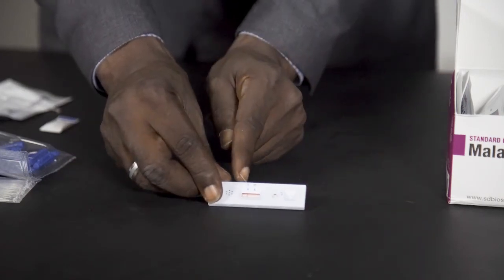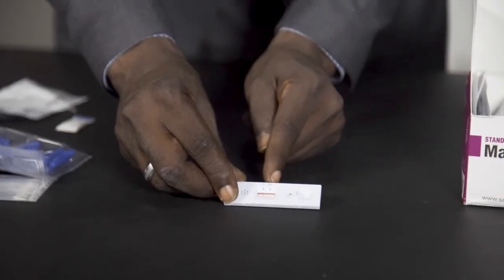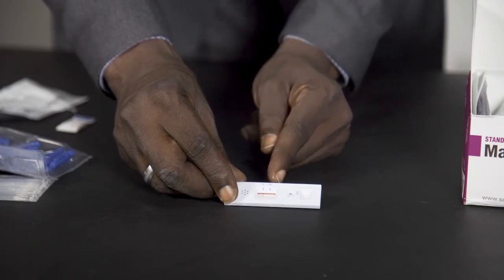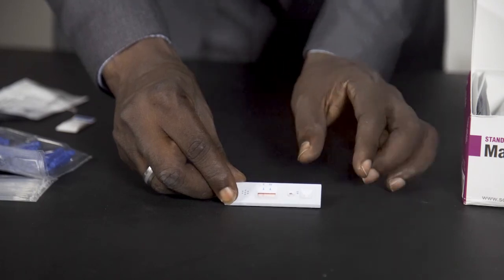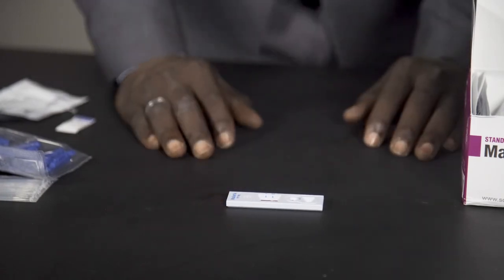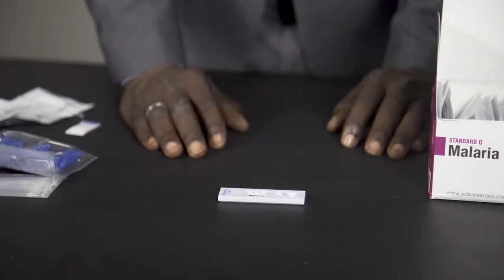You can see that there is a line on the control which is the C, and there is no line on PF, meaning that this result is negative. But if there is a line on PF and there is a line on C, it means that the result is positive. This is how to interpret the kit, and this is how to use the SD Biosensor Malaria PF and PAN.